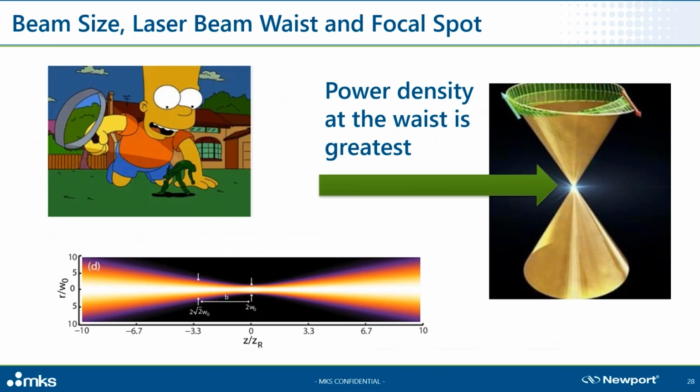Most people think a laser beam travels straight. This is called collimated. As the laser leaves the cavity, it travels through space and time. While laser propagation in ideal conditions can travel straight, called high coherence, in reality, nearly all lasers are slightly diverging. This means in application, you need a lens to focus or recollimate the beam.